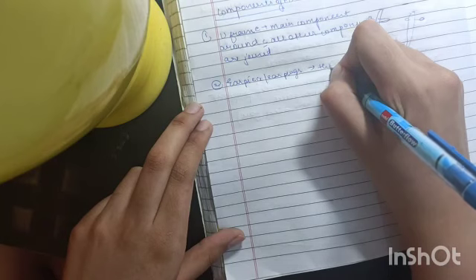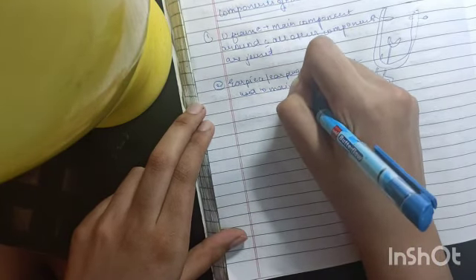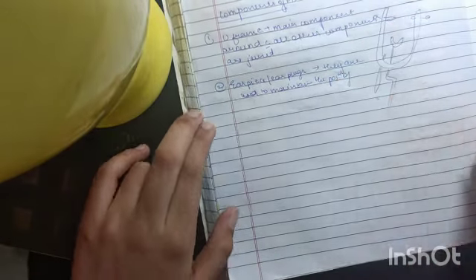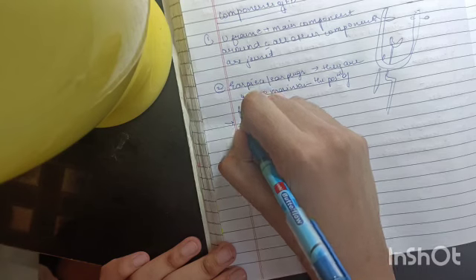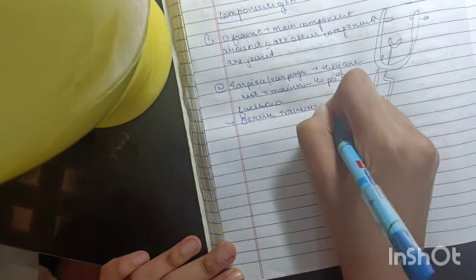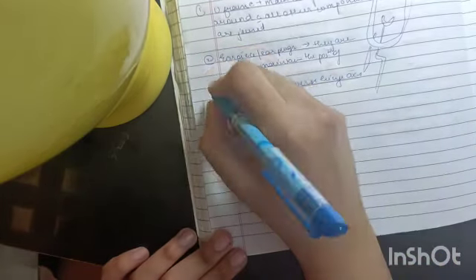They are used to maintain the position of the face bow, as well as to derive the transverse hinge axis. It is an imaginary line around which the condyles rotate.